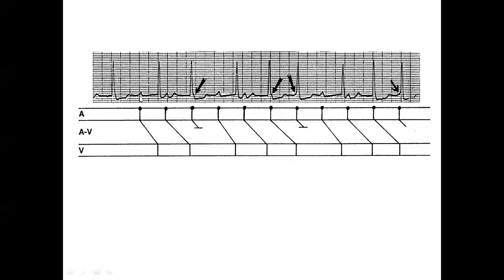Well, what's happening here? Yes, you see P occurring regularly, but the QRSs are not occurring regularly. 2 here, 3 here, 3 here. Then the first one is longer than next one, and you have to make a PQRS, PQRS. There's a slowed downstroke. There's a P hidden there. So regularly occurring P with the AV Wenckebach phenomenon. You can time it with your caliper, and it will time right here on the slowed downstroke. It will time right here where the slowed upstroke is there. So P is there, P is there.